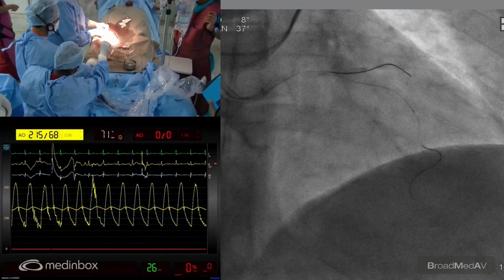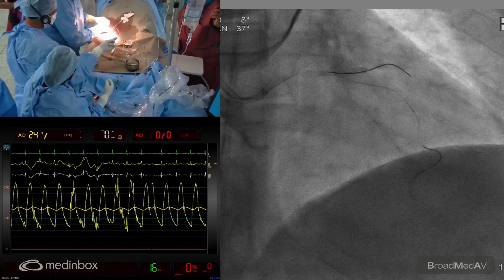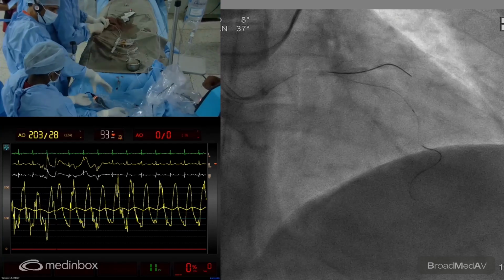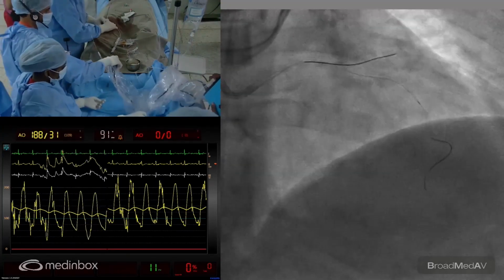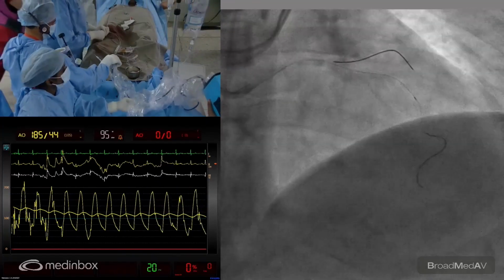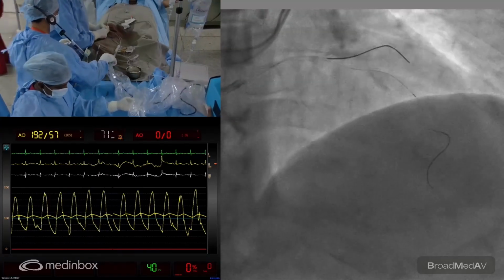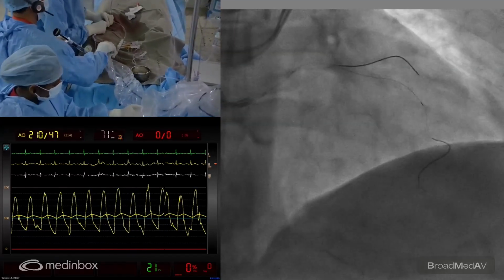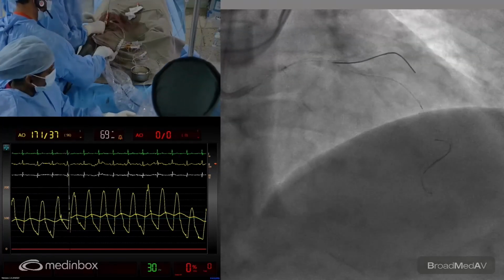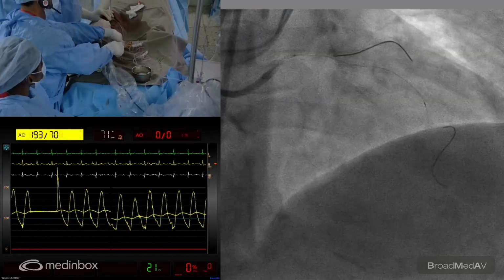Yeah. And what we're going to do now is quickly get the 3.5 coronary IVL shockwave lithotripsy balloon down into the left main. And then once we are at the site, we will inflate. There is no trouble in keeping 2 wires when we're doing an IVL. That's a good part of the whole story. I hope this IVL catheter will track down the left main. We had not much difficulty in the left main. So here is the catheter coming, and I think we are through. So we are across. The pressure is okay. Small check, please. Okay. So I think we are across the left main.